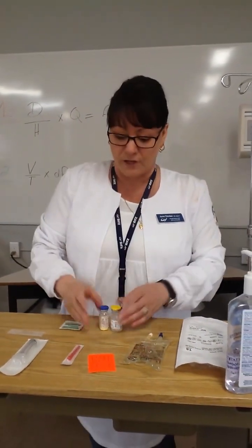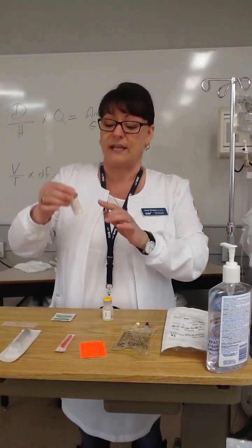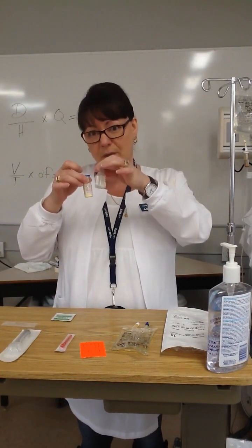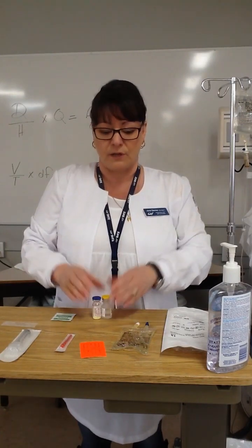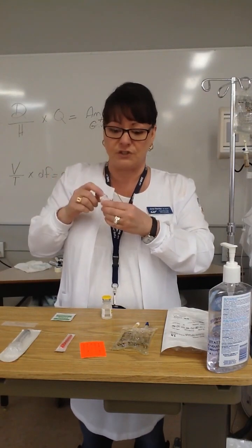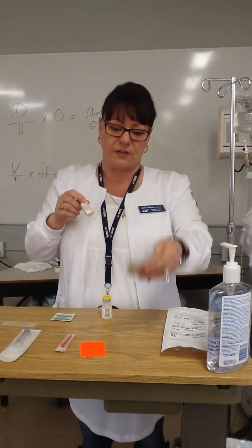So for reconstitution, I want you to understand that reconstitution means we're going to take a solute, which is this powdered antibiotic, and a diluent. We're going to add diluent to the powder. That creates a solution. That is reconstitution. We're going to further dilute, so that means after it's all prepared, we're going to draw out so much medication and we're going to add it to this secondary bag. So that's what further dilute means.